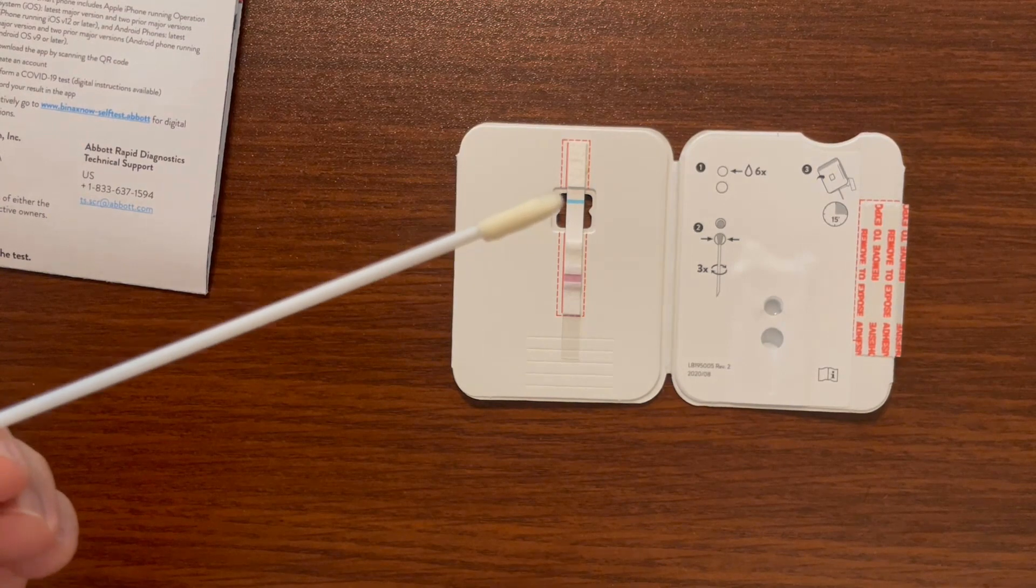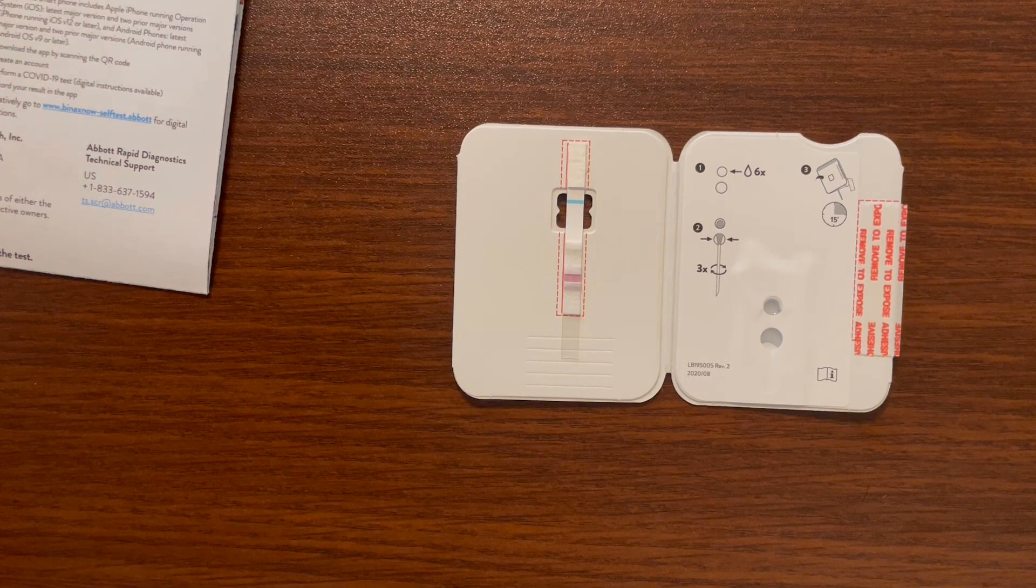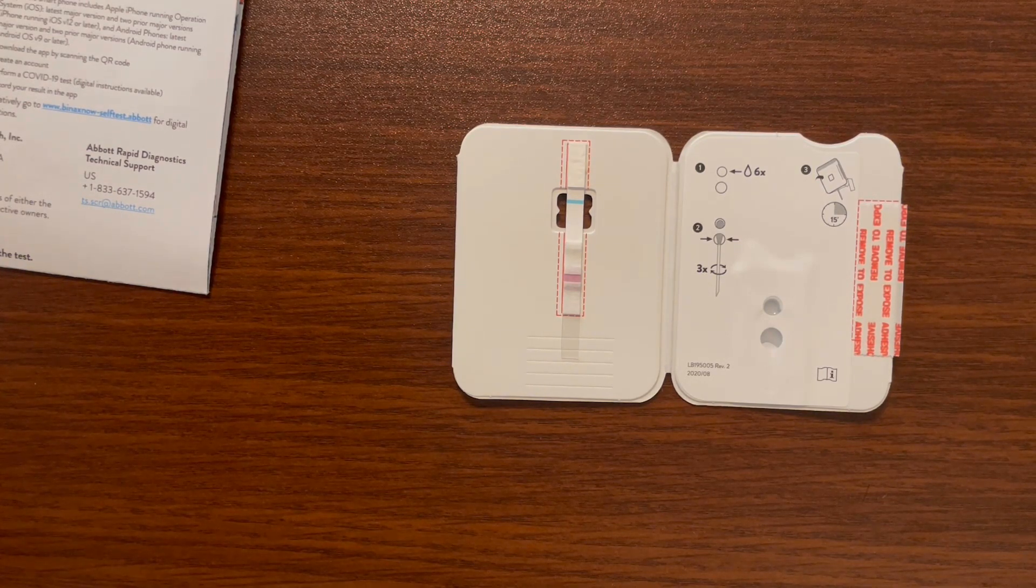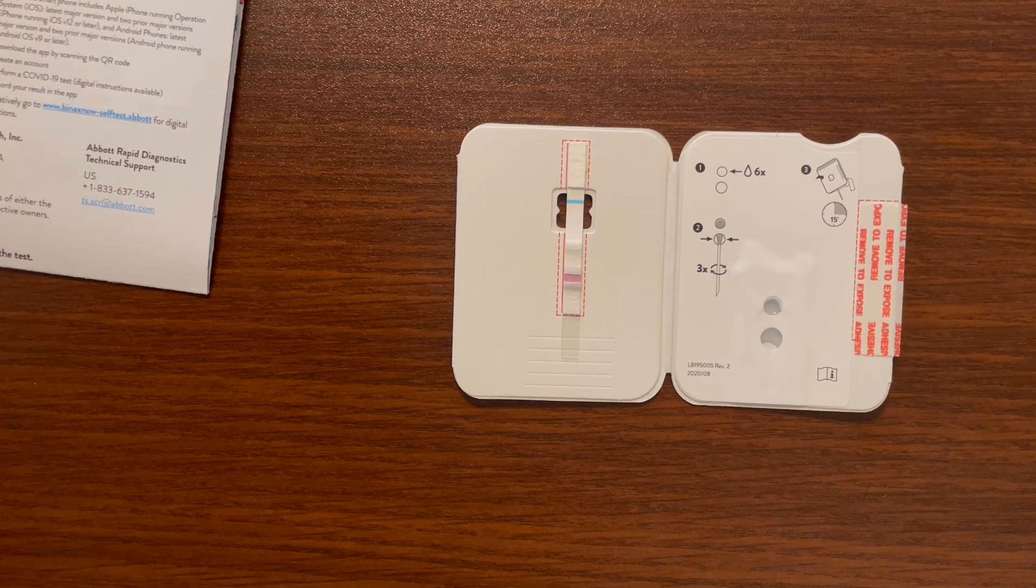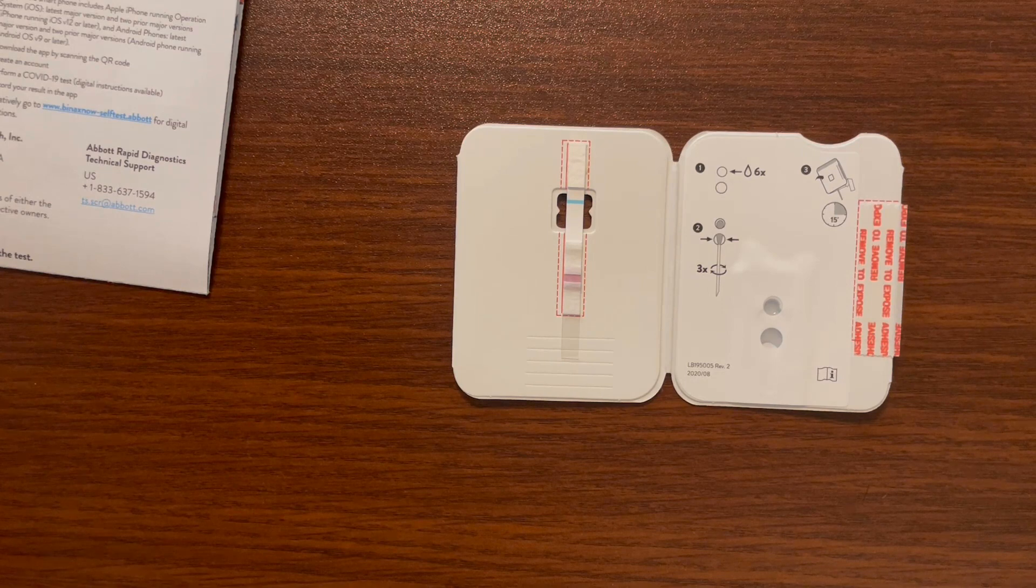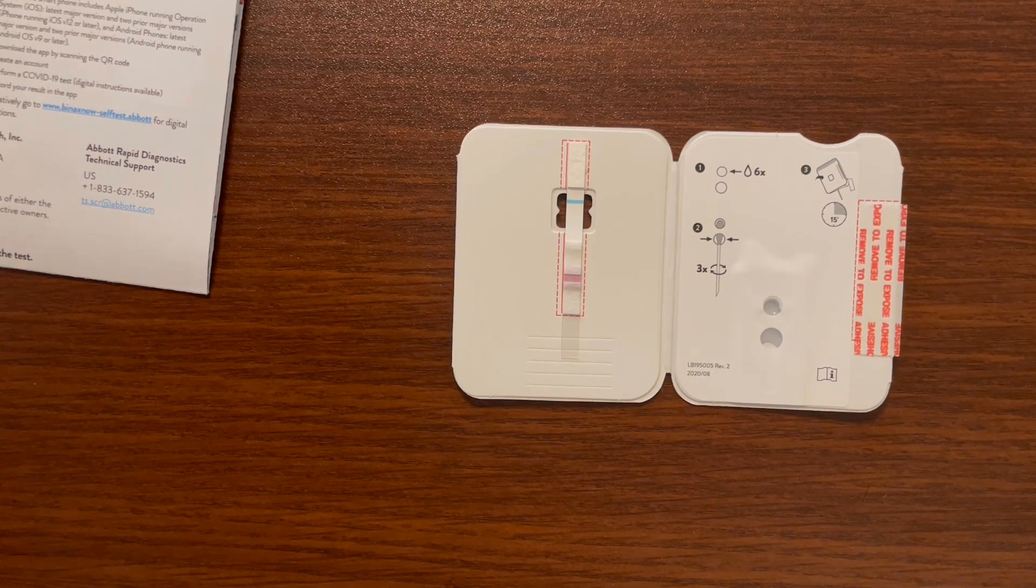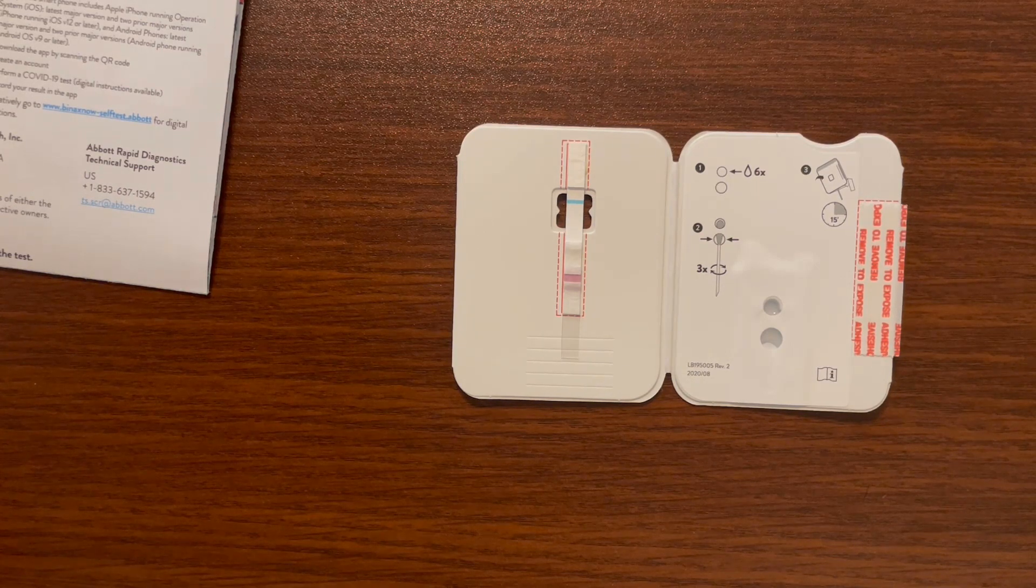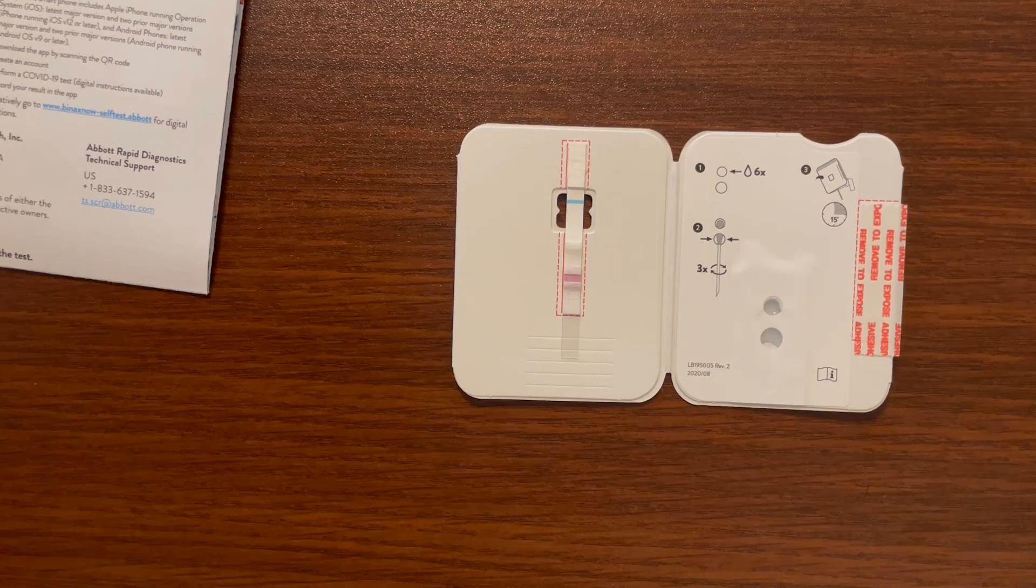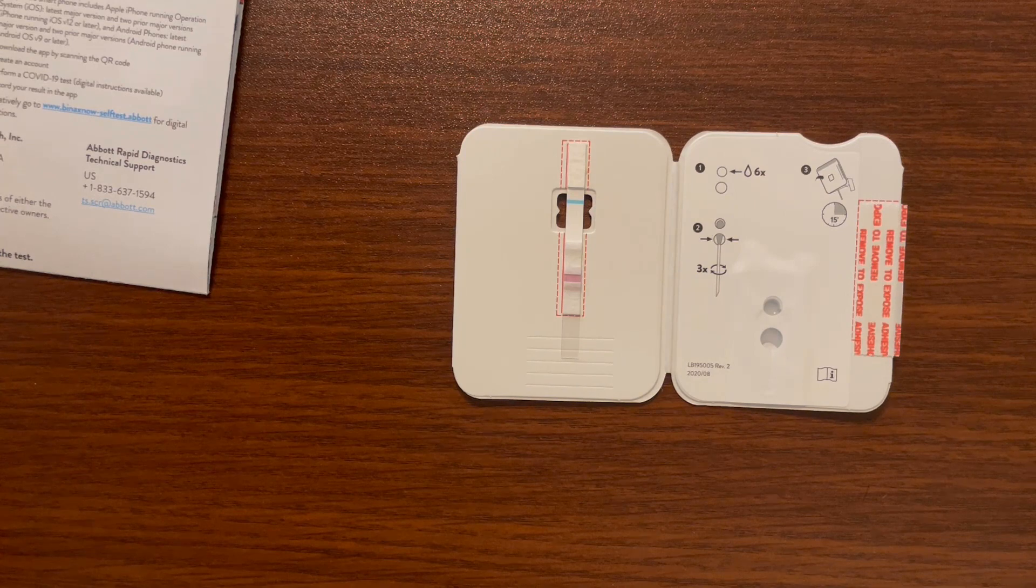Now what you're going to do is swab your nostrils, going up about three-fourths of an inch, and you're going to swab each nostril five times. Do five big circular motions and it should be swabbed for a total of 15 seconds. Do that for one nostril and then repeat for the other nostril. You're going to swab both nostrils for 15 seconds each.